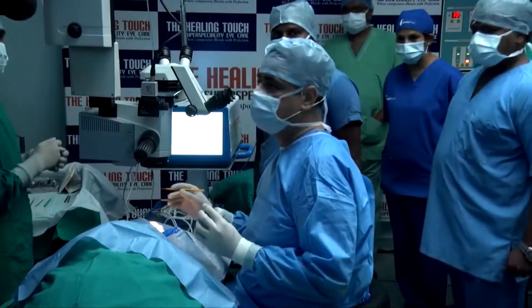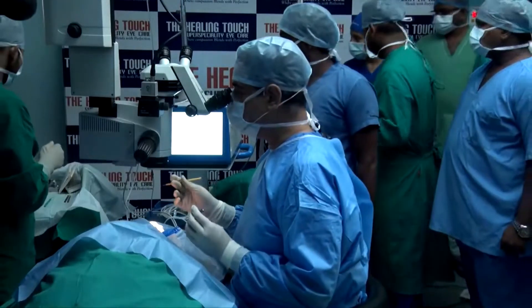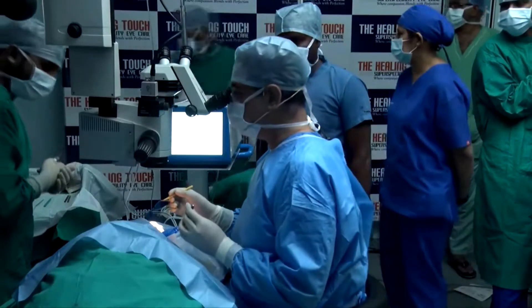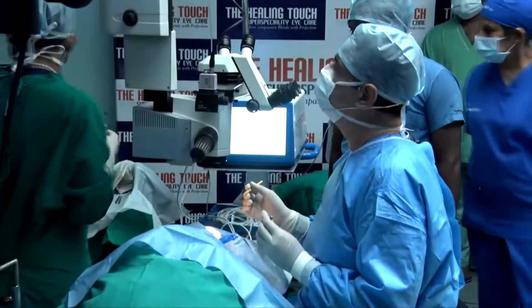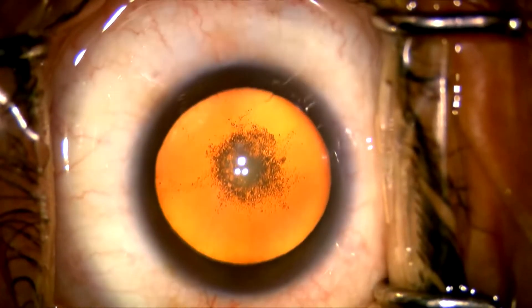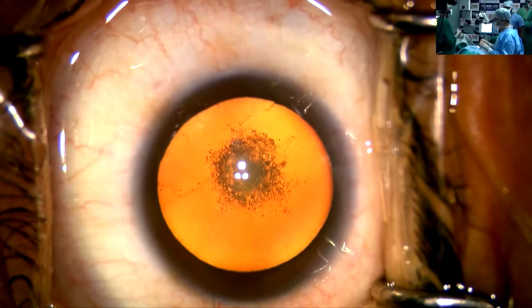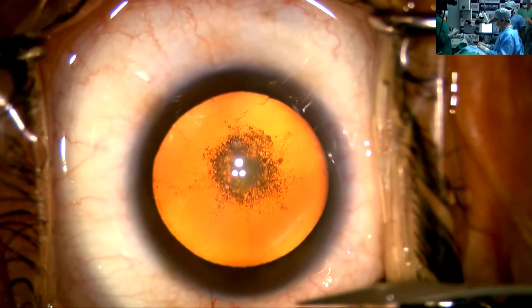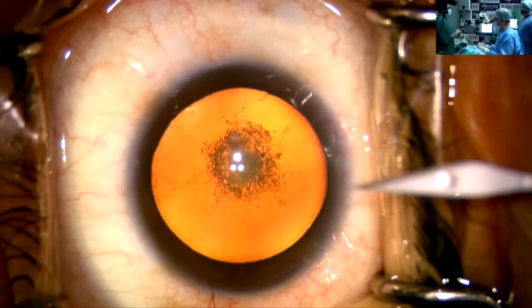I am Dr. Niyaj Manjanda and I am about to begin this case. This is a posterior subcapsular cataract. This is a young female, 40-year-old, and the other eye already has been implanted with a multifocal diffractive lens by Oro company. I am going to operate using the Hummingbird machine, which is a new machine by Oro Lab. It is a very good machine. I have been operating on this machine for the last one month and have done more than 50 cases so far.